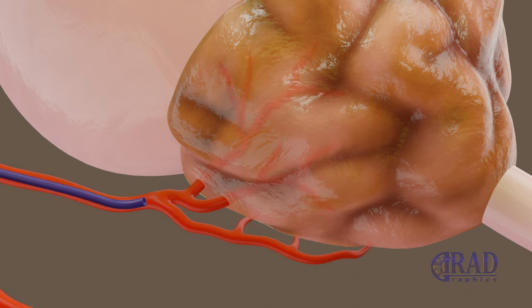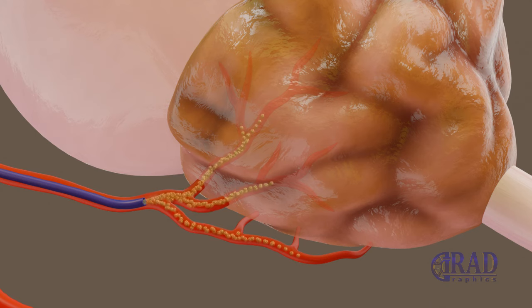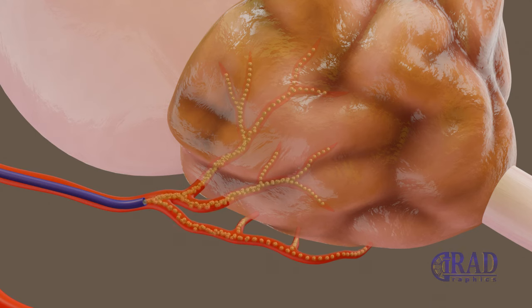The microwire is then removed and particles are injected into the ipsilateral prostate artery until cessation of blood flow.